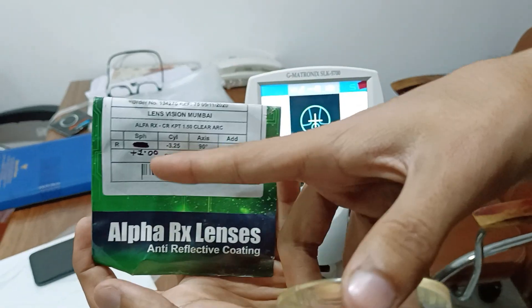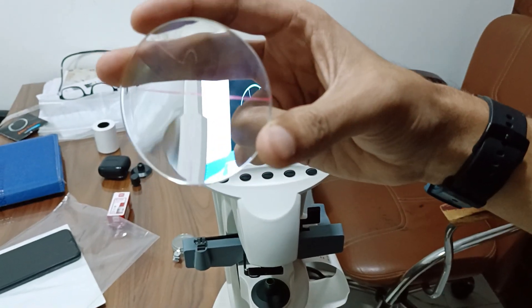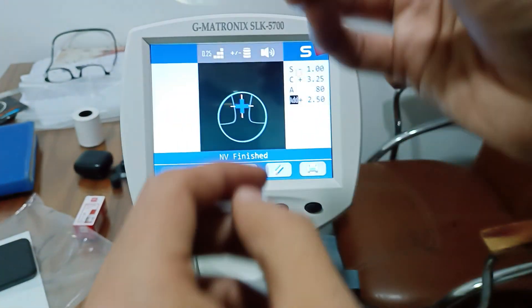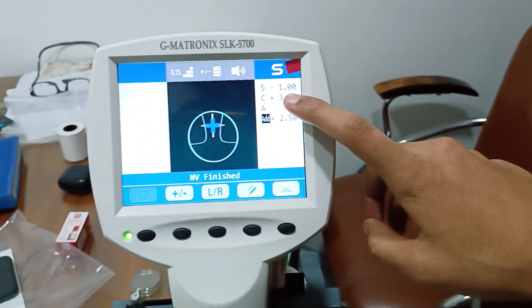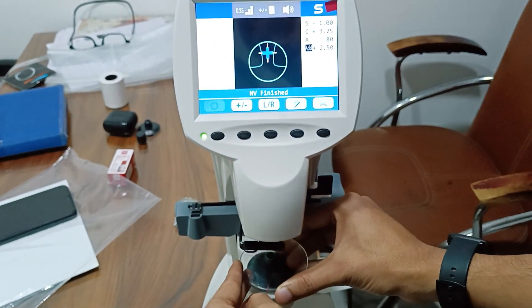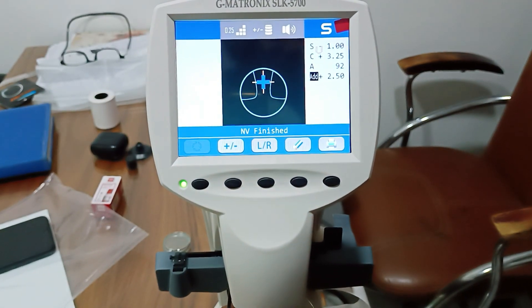This is a bifocal lens. The number is plus 1 minus 3.25, 90 degree axis, addition plus 2.50. Now I will check this bifocal lens. The approximate reading is the same because I have not used the lens bracket, so the lens is moving a little, but the reading is the same. If you want an accurate axis, you must put the lens properly without moving your hand. I got 92 axis and plus 2.50 in the second round — an accurate reading.